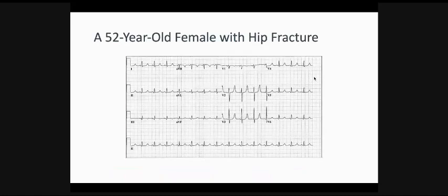Paper or pages with you handy, and we'll start with this 52-year-old lady with a hip fracture. I'll give you time to read this, and we'll go over the coding in a minute.